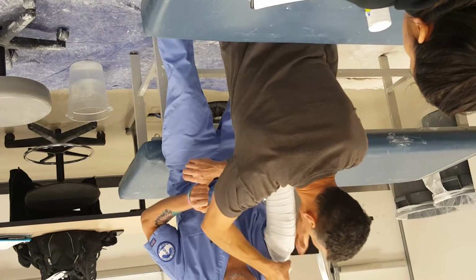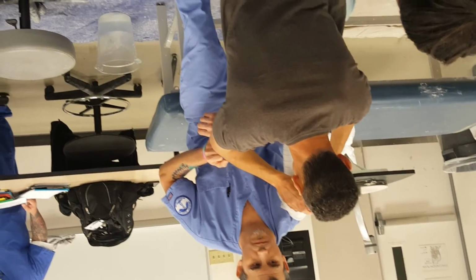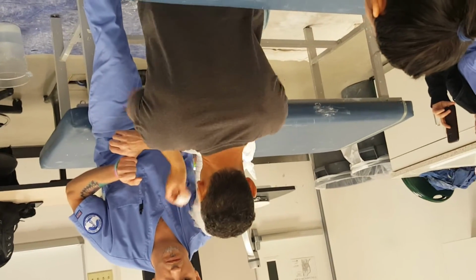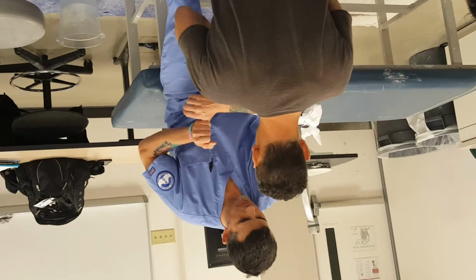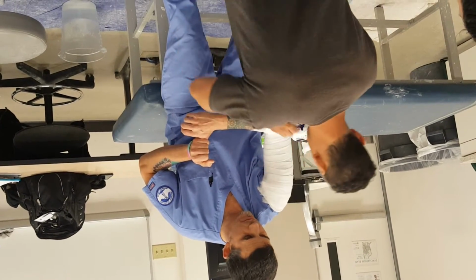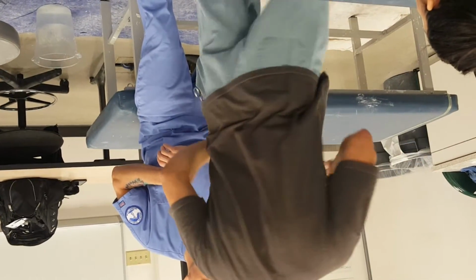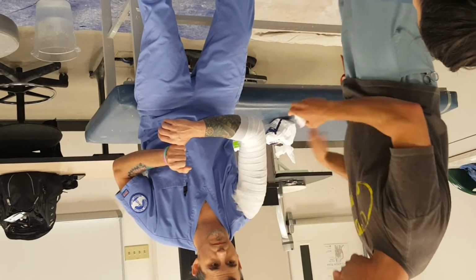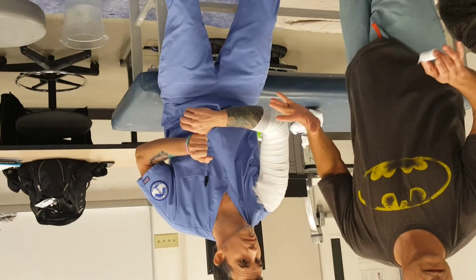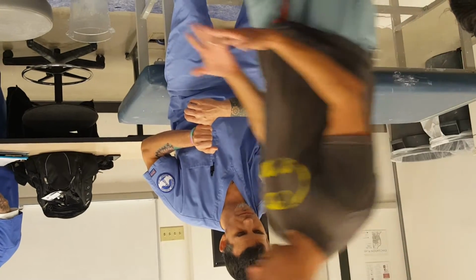Chris, what would be a reason that they cast this instead of brace? Compliance. Okay. Force compliance. The other issue is, I'm going to try to pad the areas that I'm going to mold. So your molds are going to be your medial-lateral epicondyles, just like a Munster cast. And just like a coaptation splint, you're going to watch this thing slide down your arm. From here to here, I have a 50% overlap, and that is it. Okay? Remember, I want a very thin cast. I need glue.